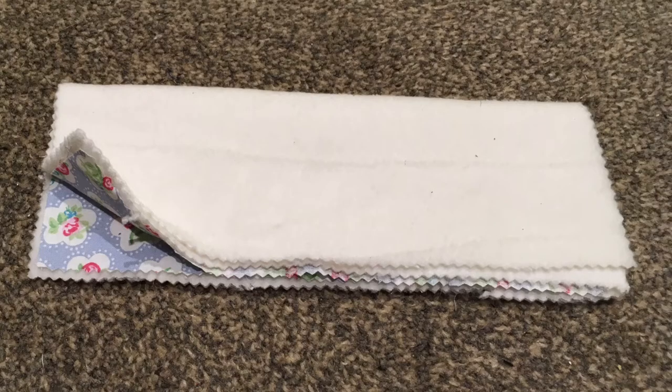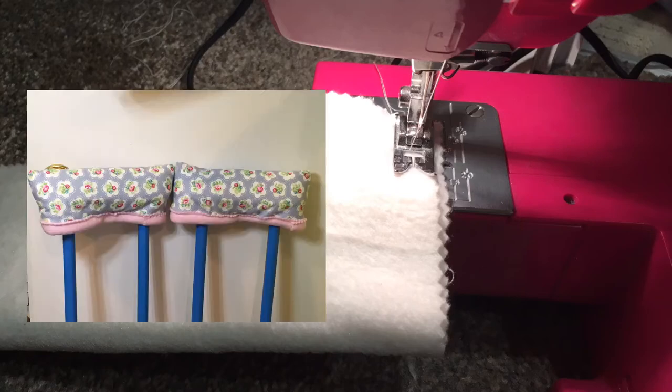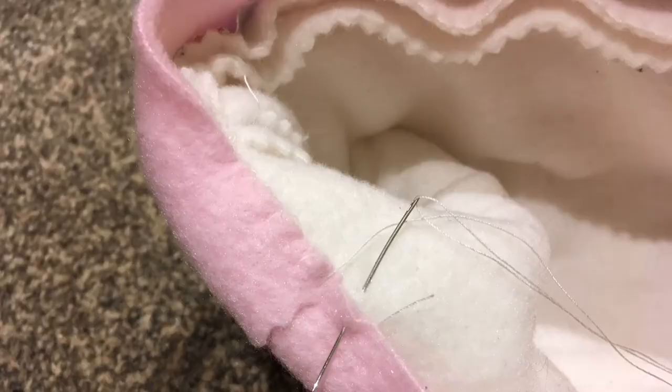I then folded all the layers in half lengthwise and sewed up the short edges to create two padded covers to go over the underarm rubber pads. Then I cut out strips of fleece to bind the edges with using my pinking shears — these strips were about two inches wide. I machine sewed the binding on the outer edge and then turned over the binding and whip stitched the inner edge by hand.